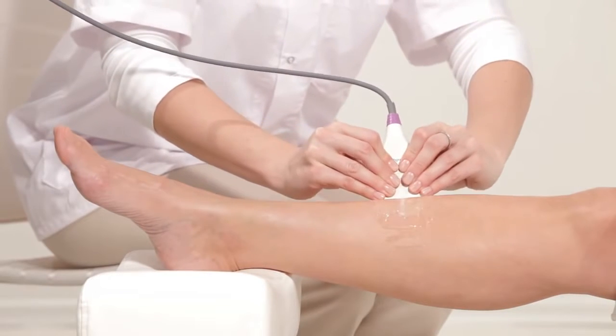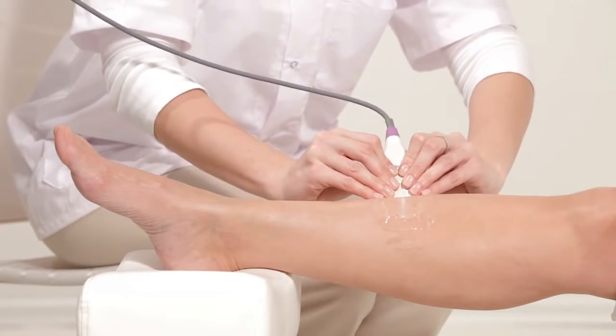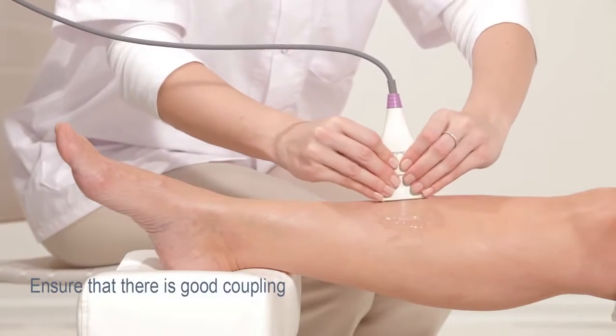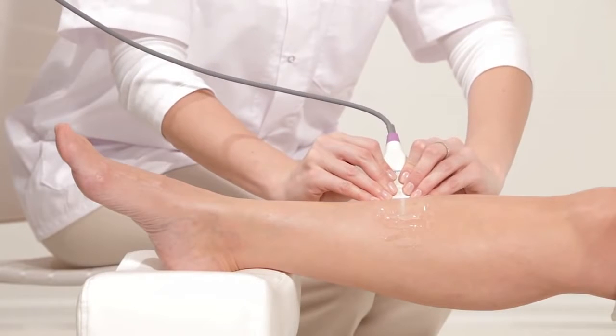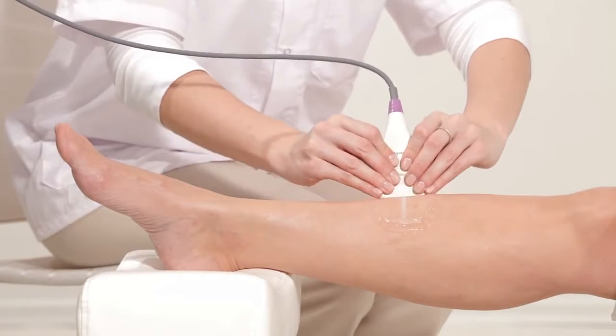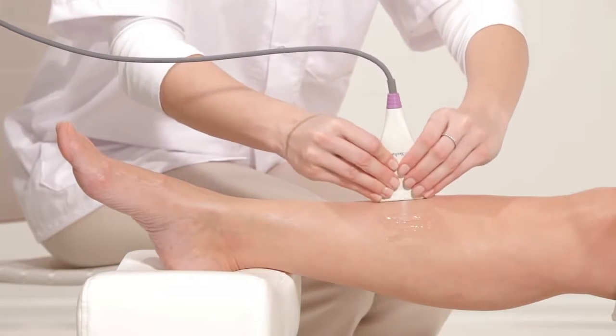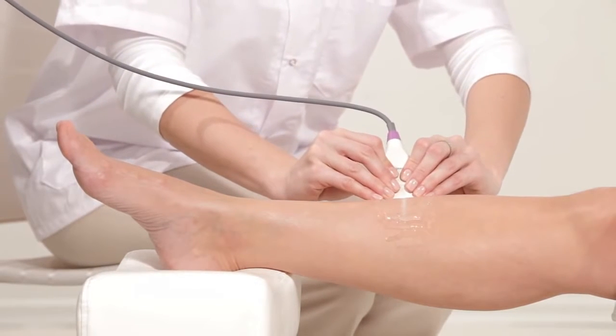When positioning the probe, apply light pressure on the surface to be scanned. Ensure that there is good coupling between the skin and probe. Begin measuring the bone on its flat surface and move the probe backward and forward 3-4cm in each direction.